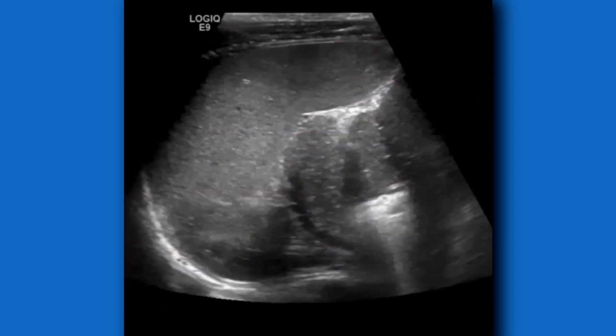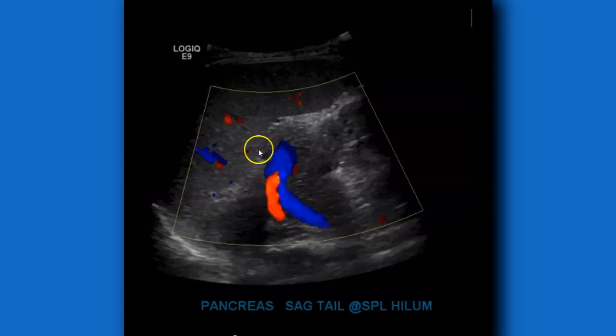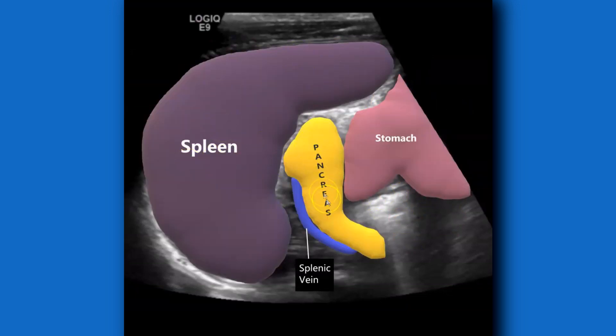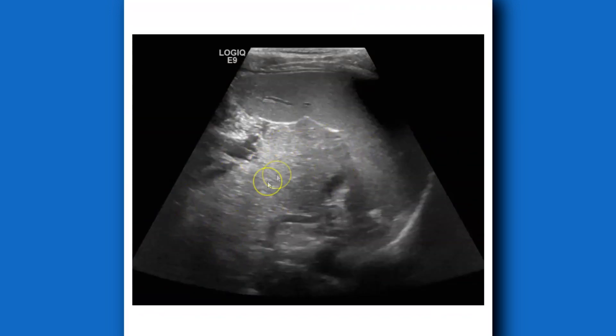In slender patients or patients with good scanning windows, you can also use the spleen as a window to look at the tail of the pancreas. Here's the spleen, the tail of the pancreas, and the splenic vein. With color Doppler you can see the splenic vein and splenic artery going towards the splenic hilum. One reason I like getting the pancreatic tail at the splenic hilum is you can see any lesions, cysts, or pseudocysts. Here's a case of pancreatitis with a large pancreatic tail — normally 1.5 to 3.5 centimeters — and you can see the inflammatory changes there.